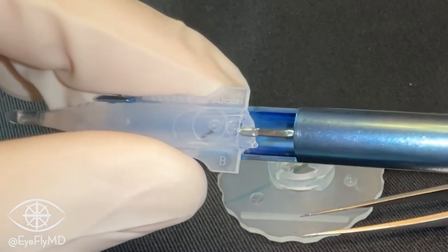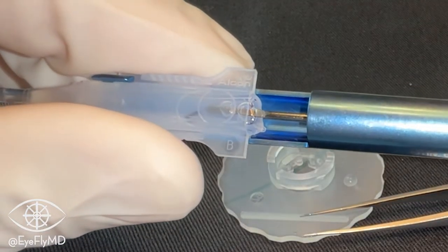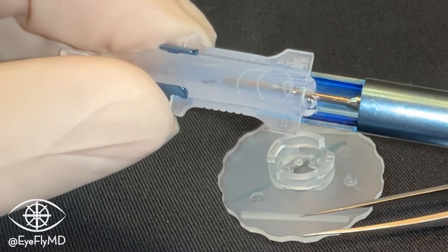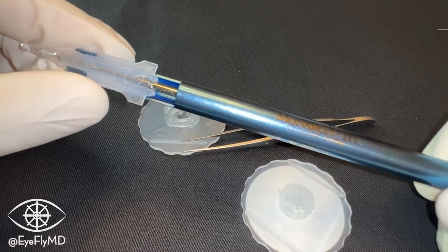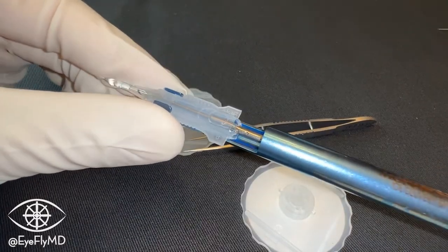Notice the plunger isn't hitting that trailing haptic now — it's nice and out of the way, because again it's very fragile. As we start advancing, we can see the leading haptic is in its Z orientation and the trailing haptic is straight. Once we start engaging that screw portion and twisting, we can see by the mark on the IOL it's moving towards the edge of the injector and will be ready for implantation.